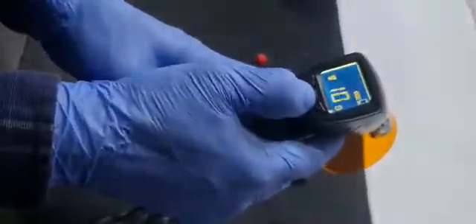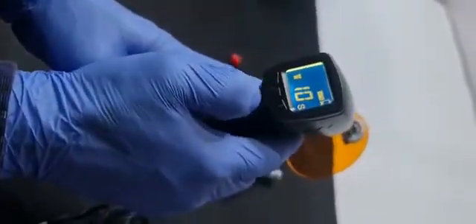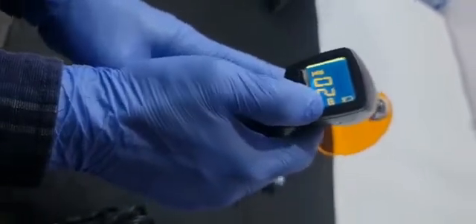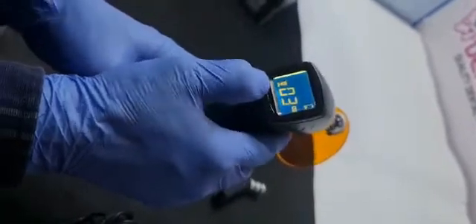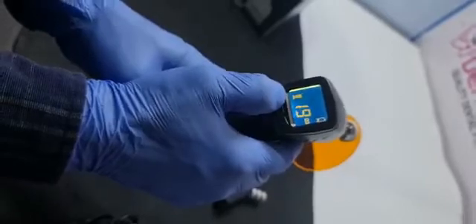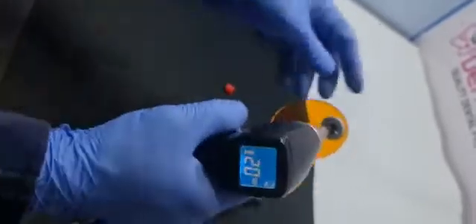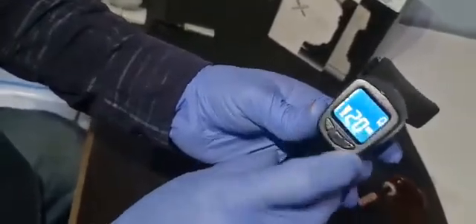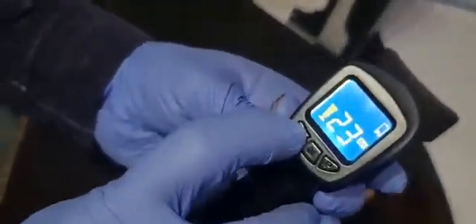First of all, you have to understand the modes. This mode is just used for bleaching purpose. It is used in minutes when you use this bleaching mode. This mode is for bleaching where it is written M. You can adjust the time according to your need.